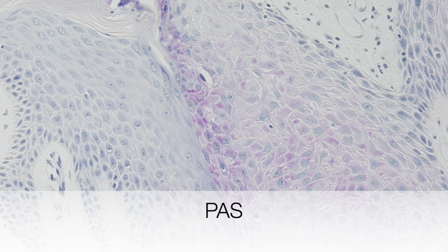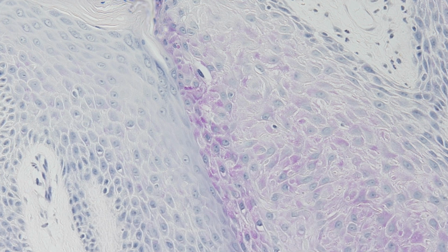This is the biopsy stained with PAS, or periodic acid Schiff.